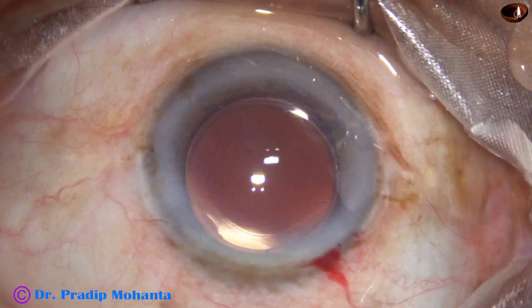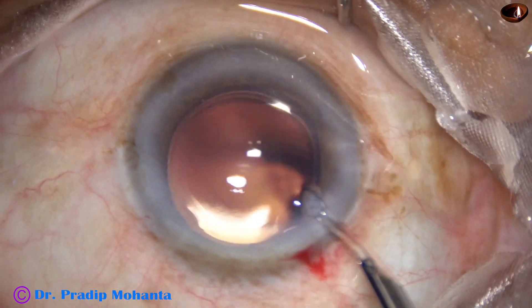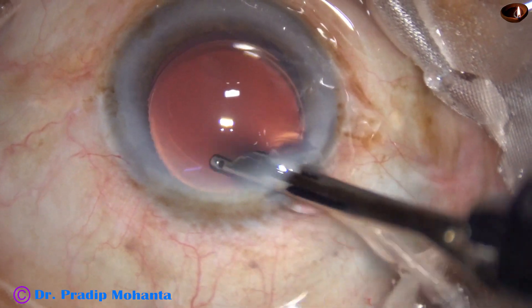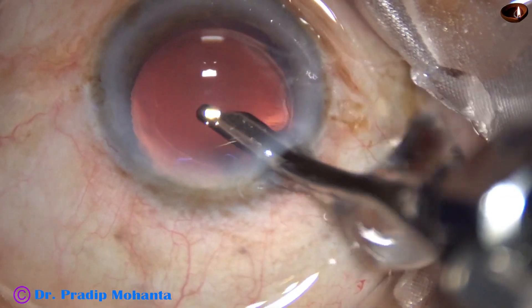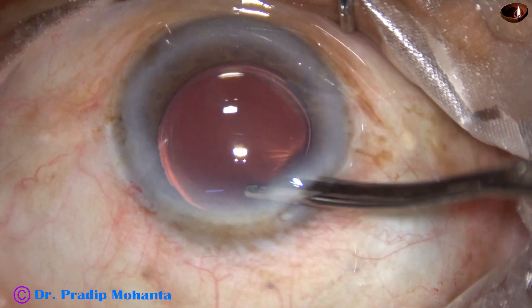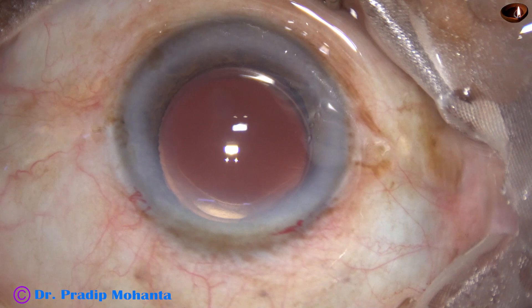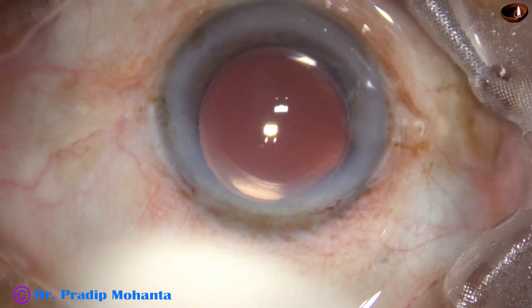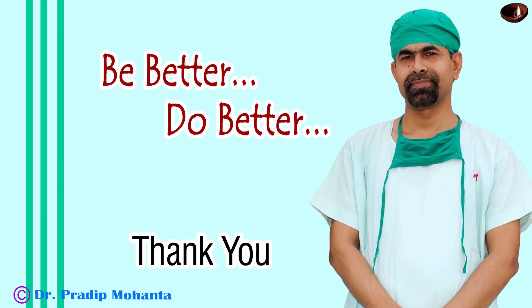A drop of moxifloxacin is applied and now this is hydration of the corneal stroma at the side port so that leakage from the side port stops. The main wound has been constructed in such a way that it does not require any hydration. This is the final lavage of the anterior chamber. After a thorough lavage, the anterior chamber is formed and the integrity of all wounds is checked with a cotton-tipped Johnson swab.